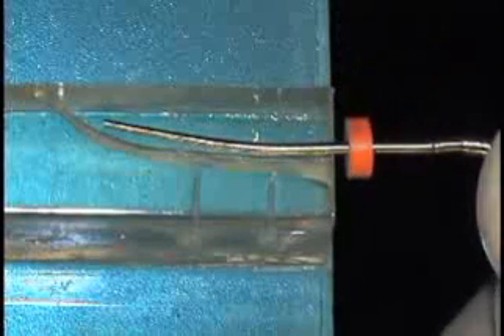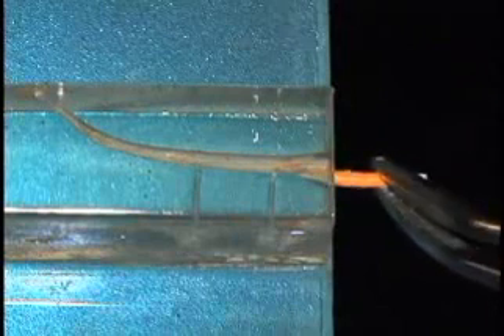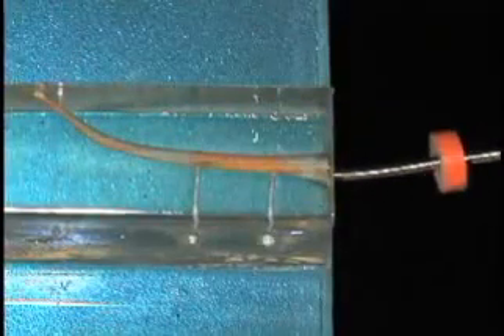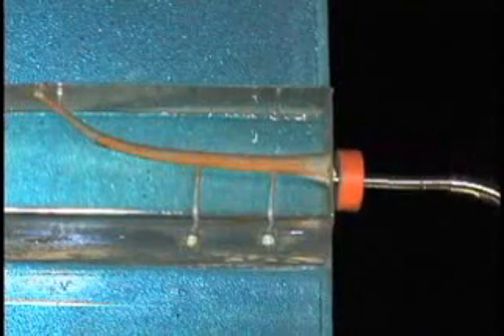After the cone is cemented, it's going to be seared off at the orifice. We push the high heat icon on the System B heat source to sear it off, then condense the gutta percha at the orifice with a fat stainless steel hand plugger. After that, we bring the continuous wave plugger in cold first — push on it, hit the button, and it'll immediately take off.